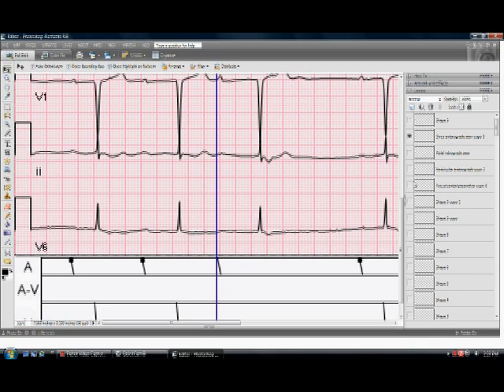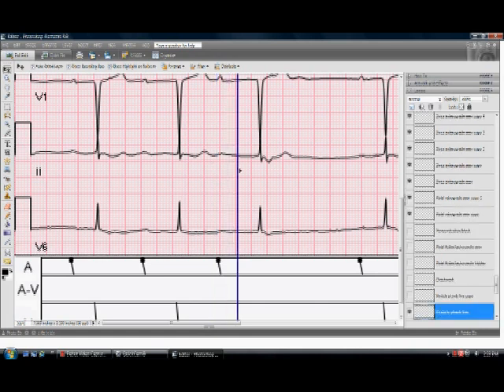I would cap that off with a black dot here and then I would move the plumb line over to the beginning of the QRS.